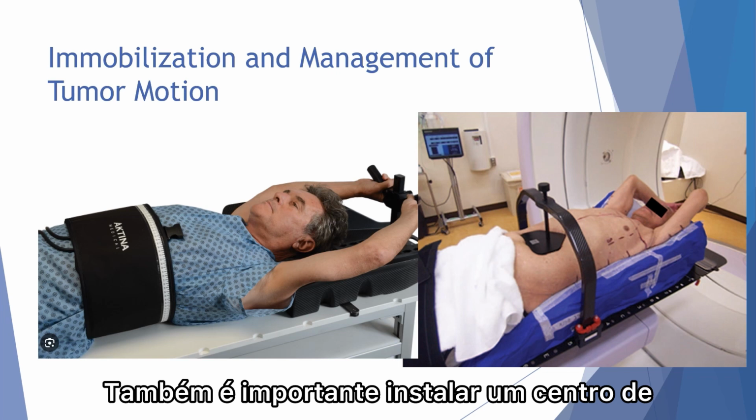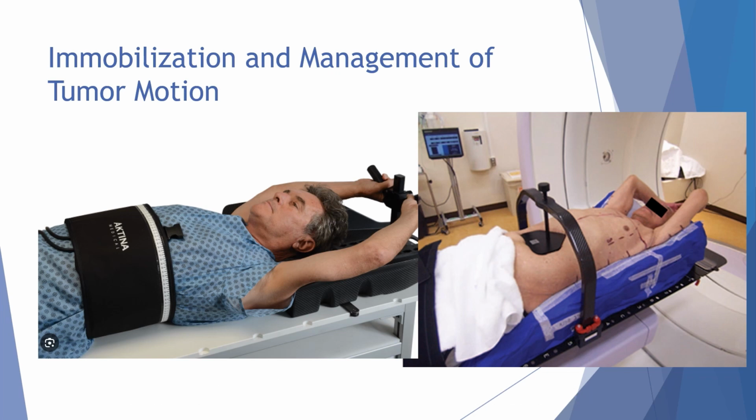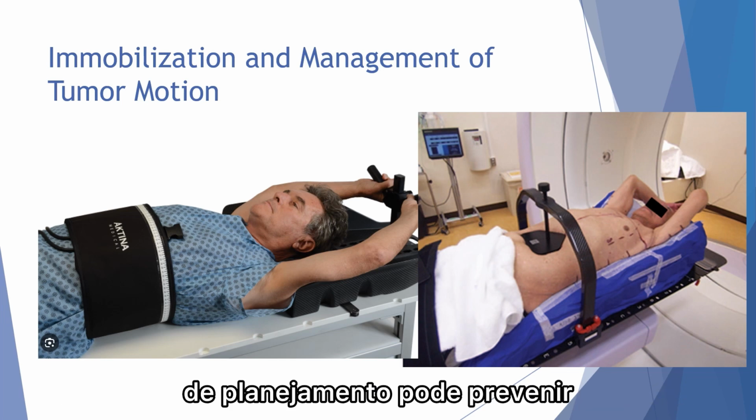It is also important to set an isocenter during simulation. This can help further downstream. Minimizing any shifts during the planning process can prevent further errors.